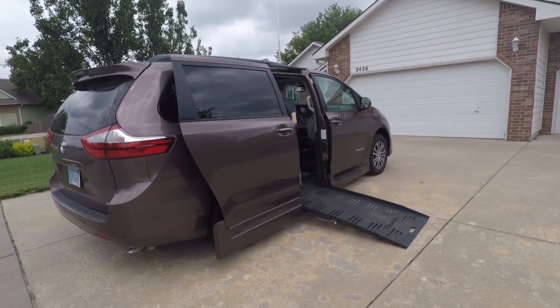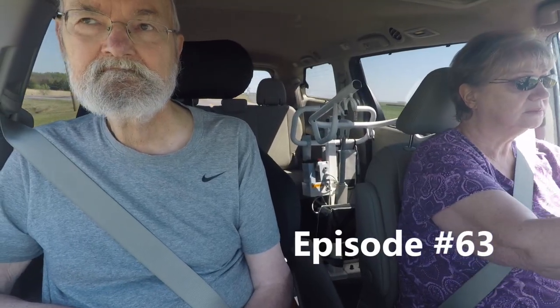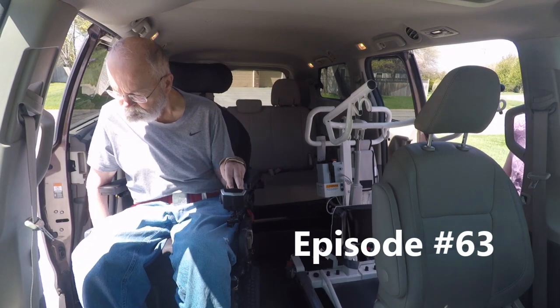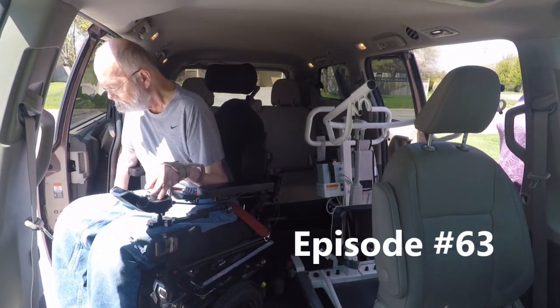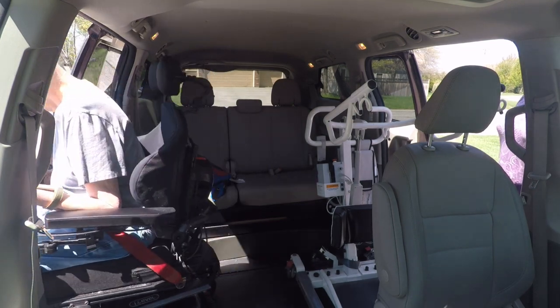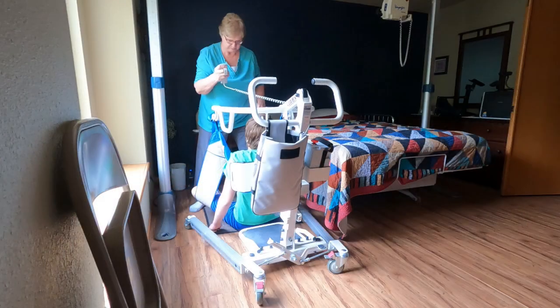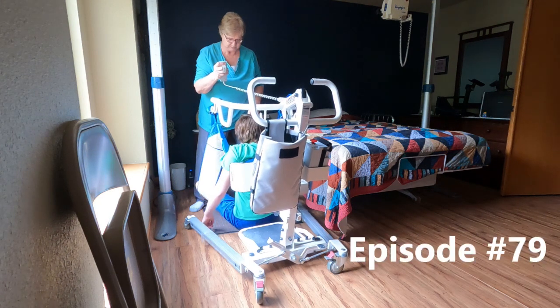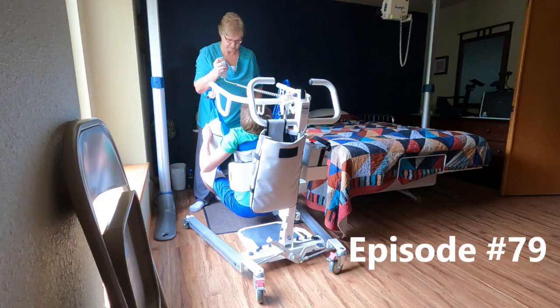Anyone who is in the advanced stage of IBM and also uses a power chair and a ramp van to add to their overall mobility should remember that your sit-to-stand lift can most likely be loaded into your van to be used elsewhere other than in your home, as I showed in my 63rd episode, and in the 79th episode, Cindy and my grandson are featured in a video that shows you how to pick a person up off the floor using a sit-to-stand lift. Watch those two videos for additional information.